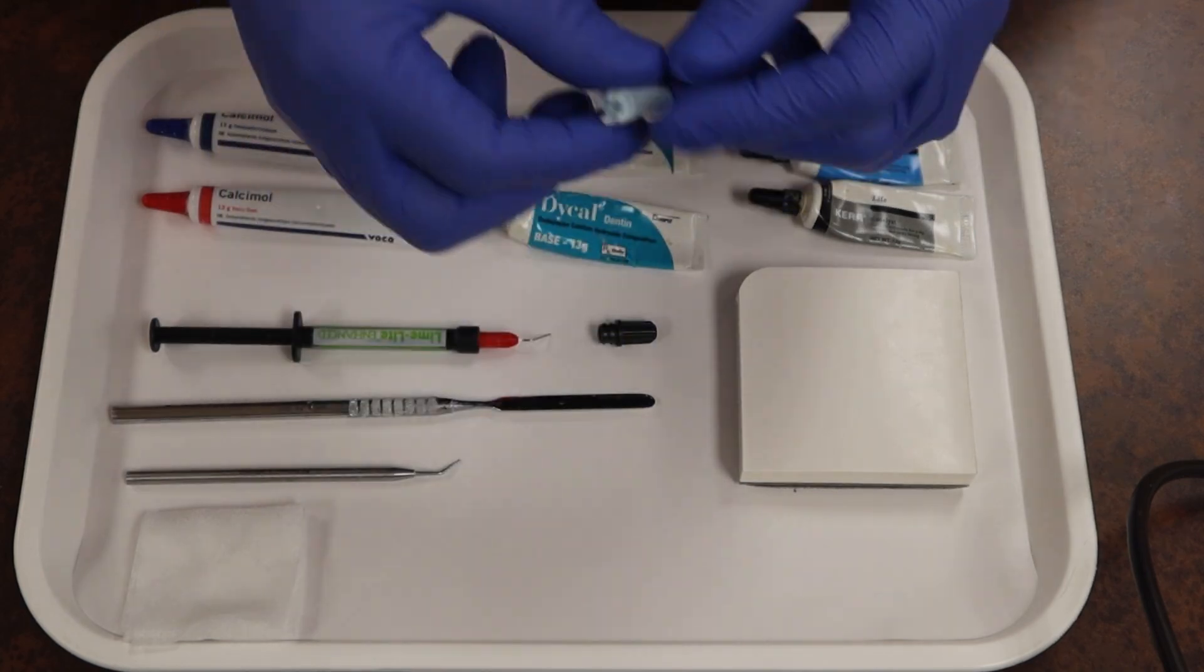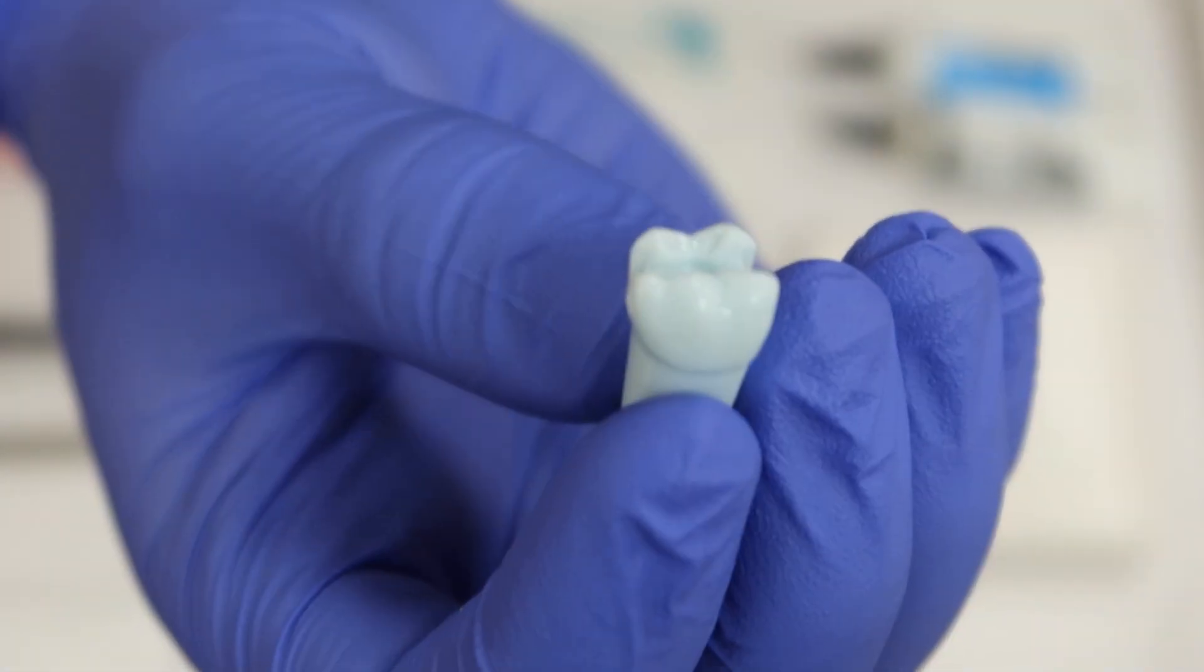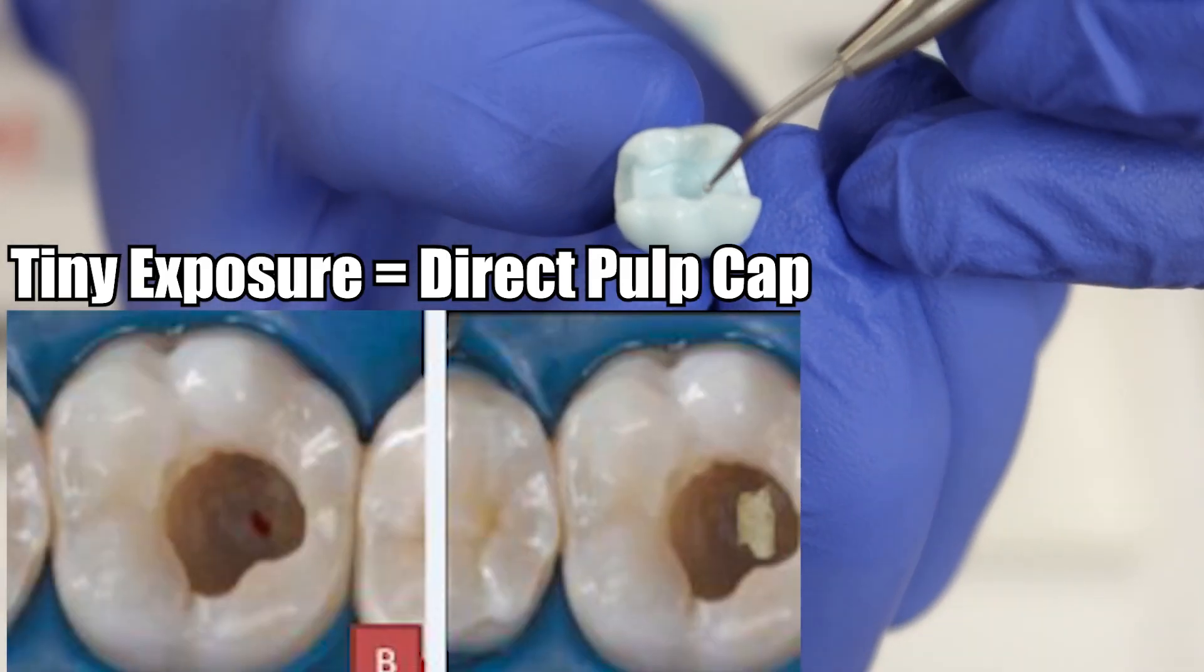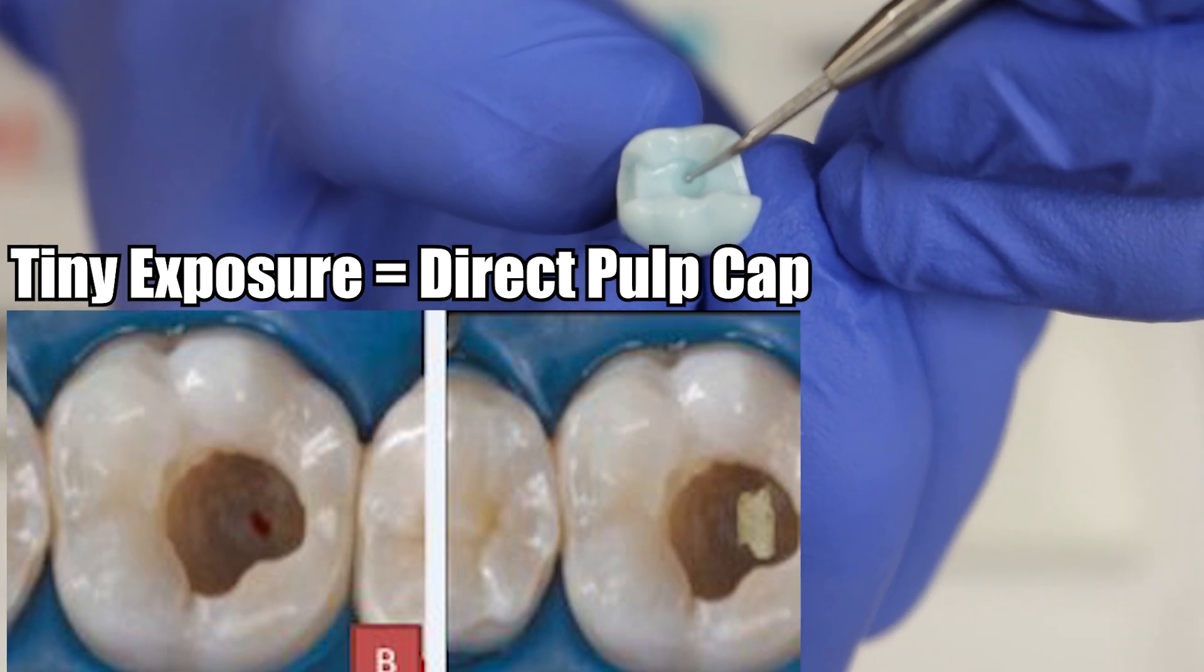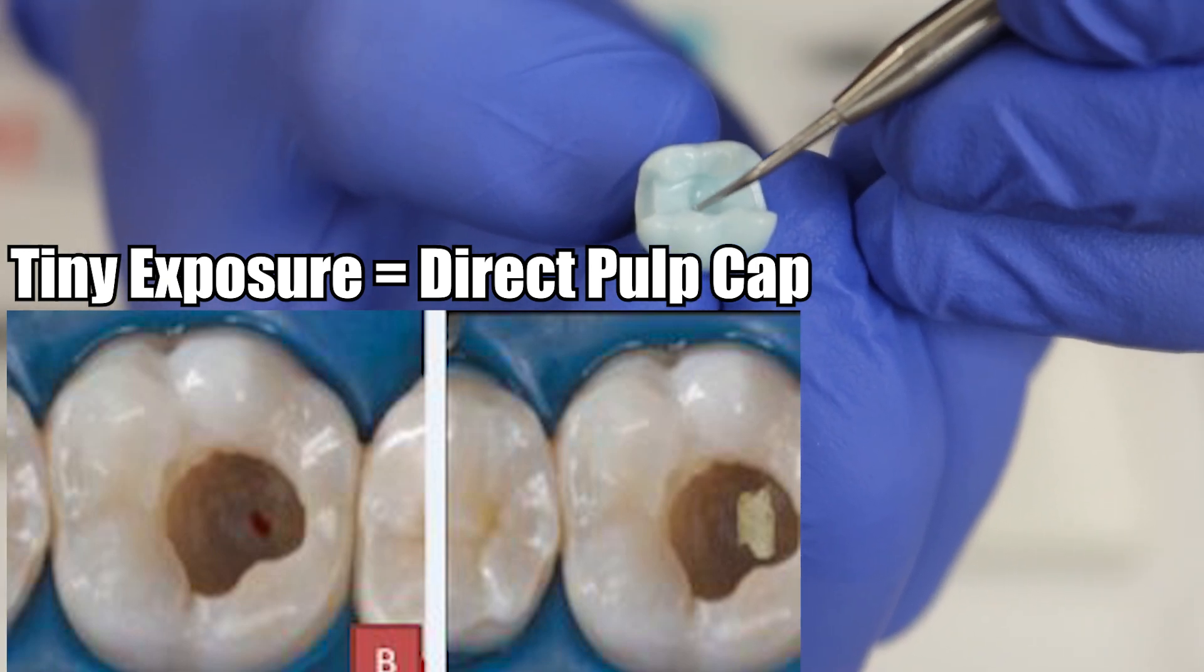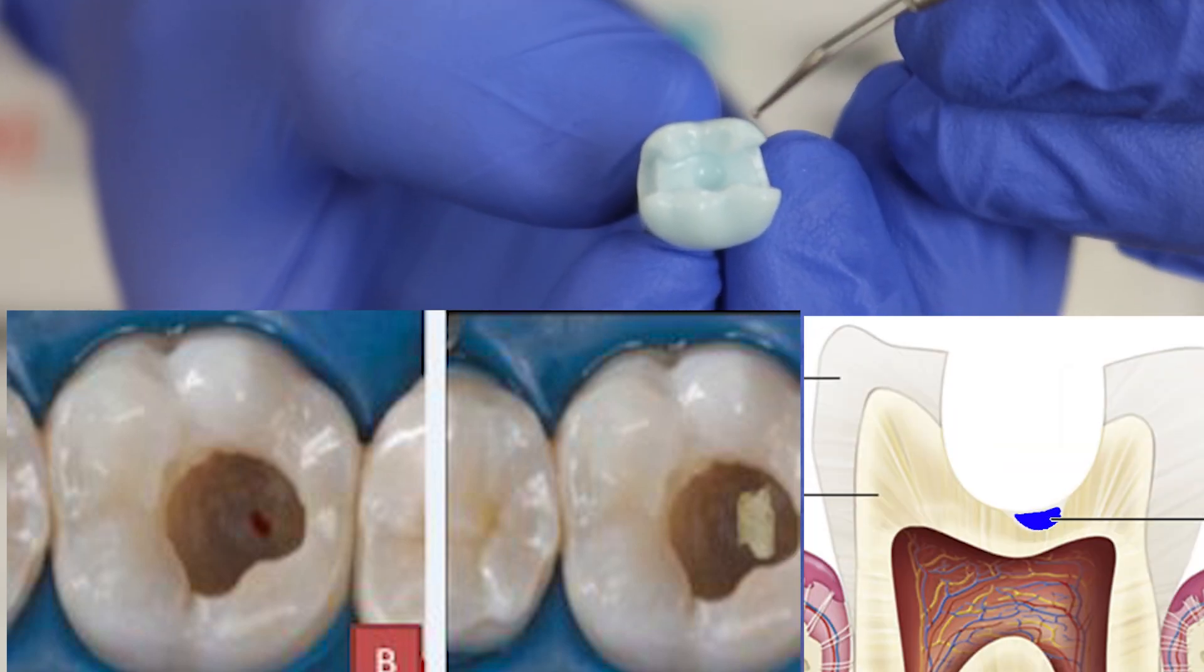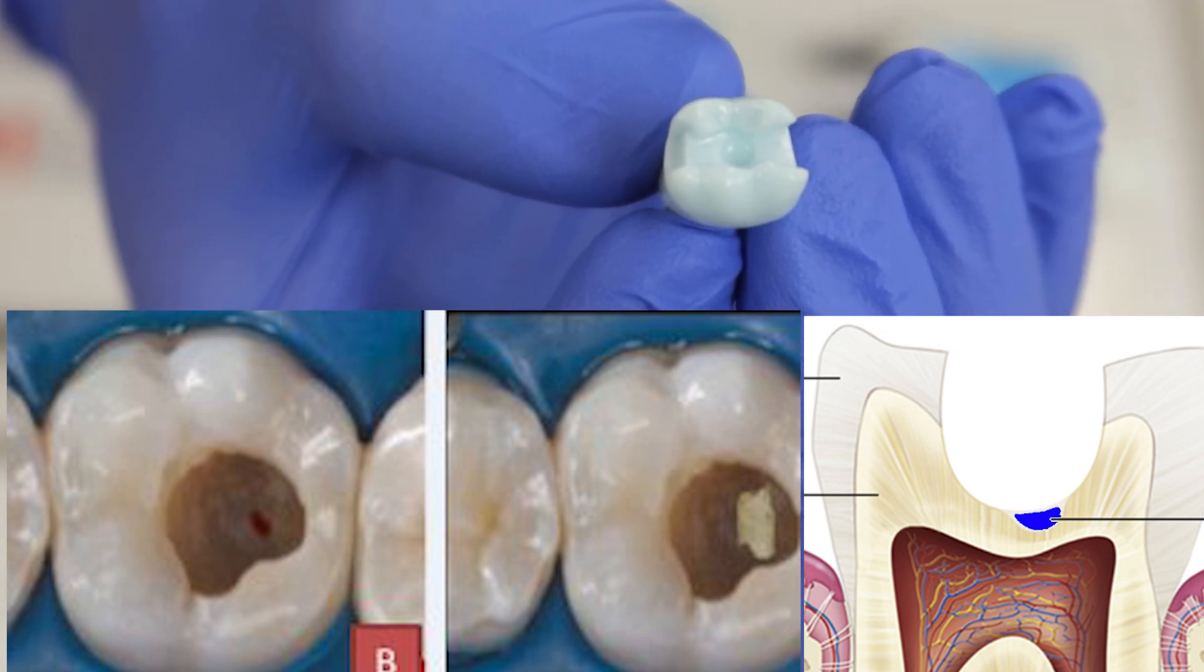With that, that comes to the most important part, which is going to be our tooth in general. With that, we have a molar right here and it has been prepared and cut out where the cavity has been removed. And it has this small little scoop out area where the tooth decay went deeper in this portion than the other regions that we have here. And so our Dical or Calcium Hydroxide is going to be placed right here in the deepest area of this tooth as a dot in this dead center.